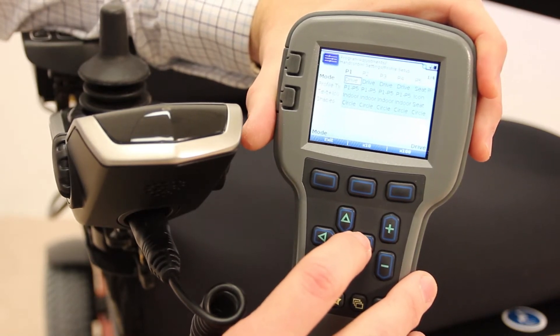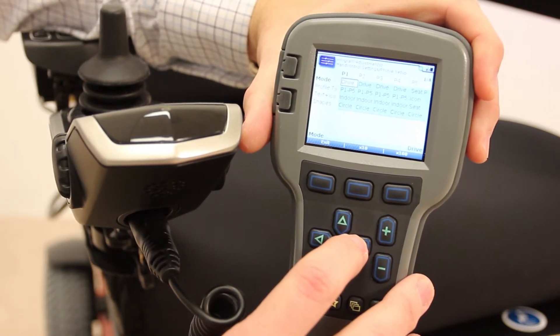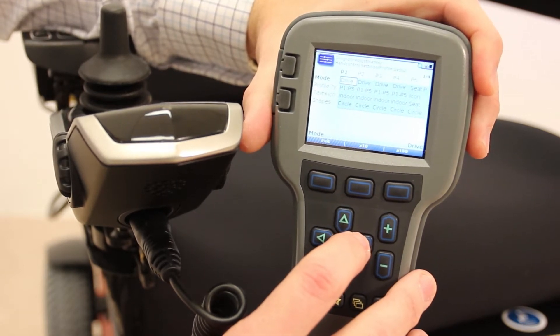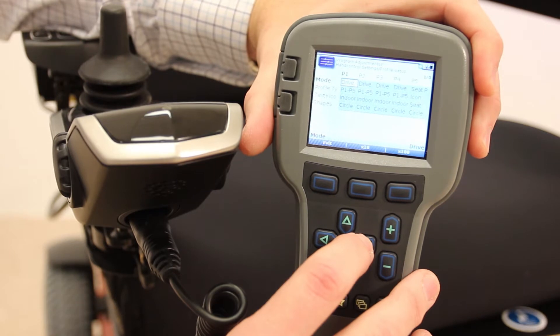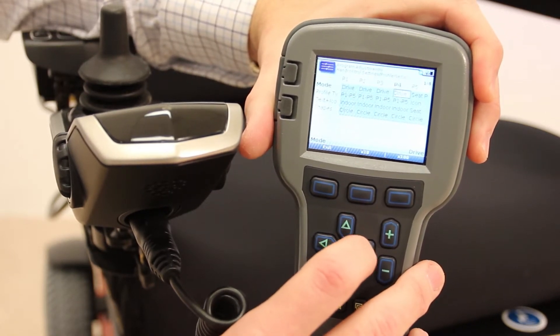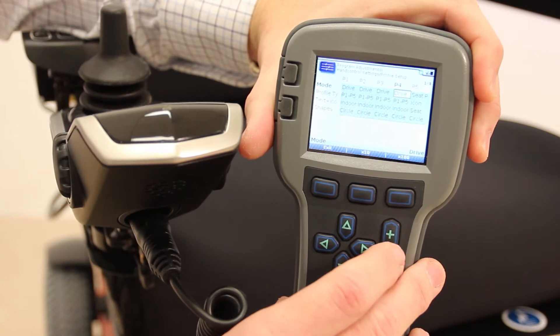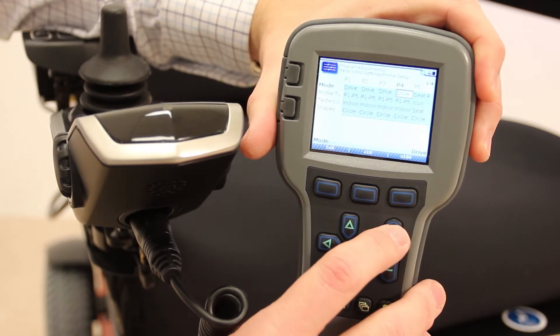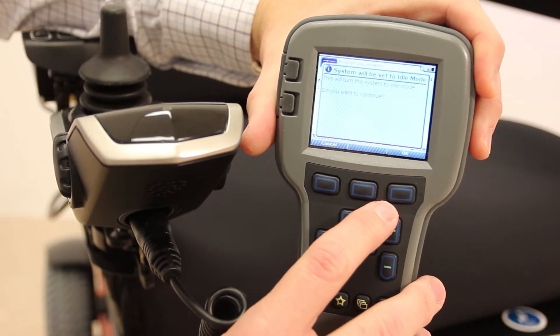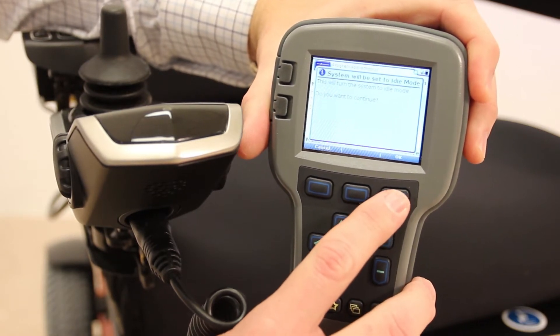Now for our purposes, profile 1, 2, 3, and 4 are drive profiles, and profile 5 is a power seat profile — that's typically how this comes off the production line. We're going to go over to profile 4 and hit the plus key. It's going to ask, do you want to continue to go into idle mode? The answer is okay.